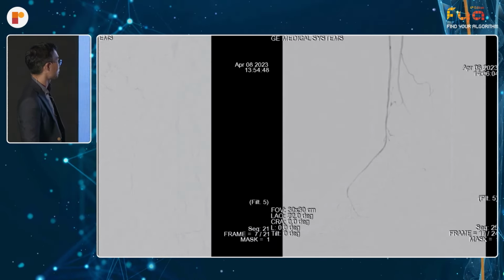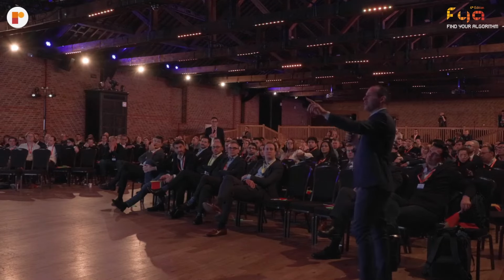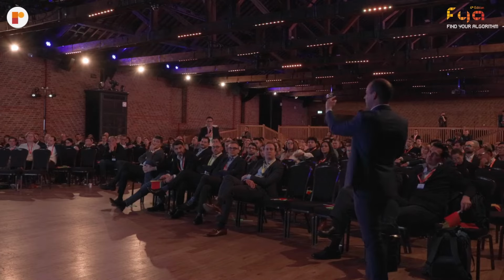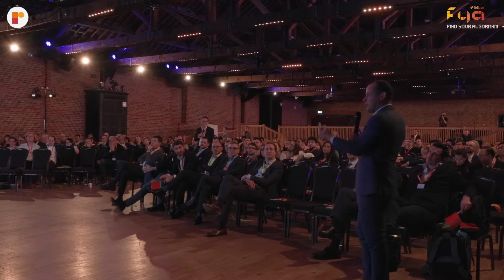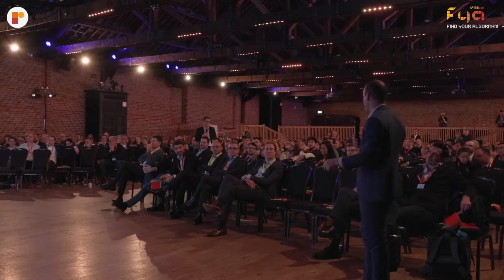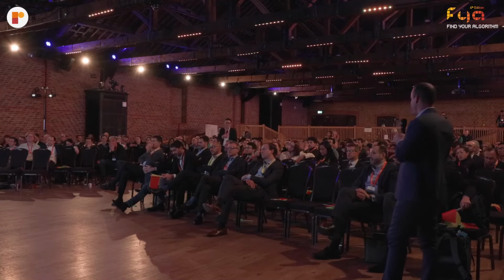and also the posterior tibial artery. Is Alessio Spinelli here? Alessio, are you here? No. Because he calls it the sheep technique, which I love. The sheep. Yeah, you go with the little retrograde access as a dog, and then you go back, and the sheep wire comes back from the top. So I think it's a good way to describe this great thing.